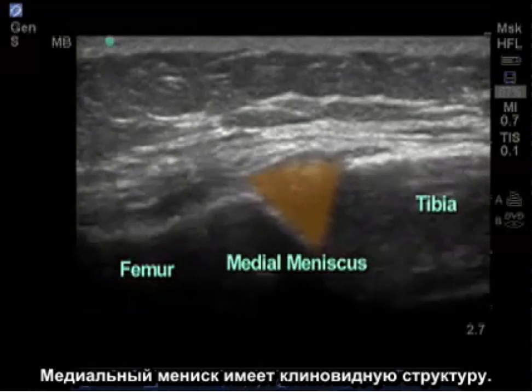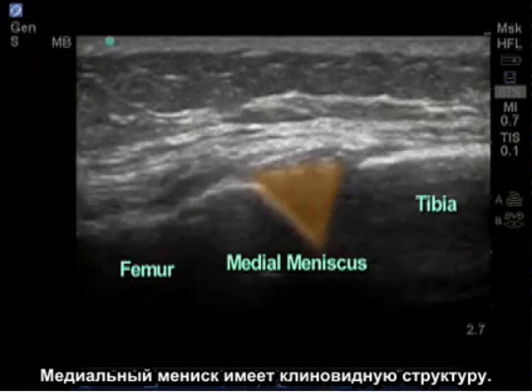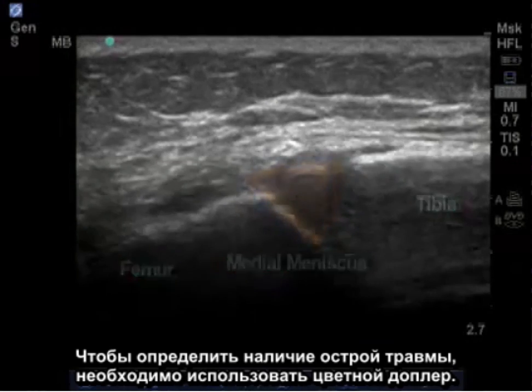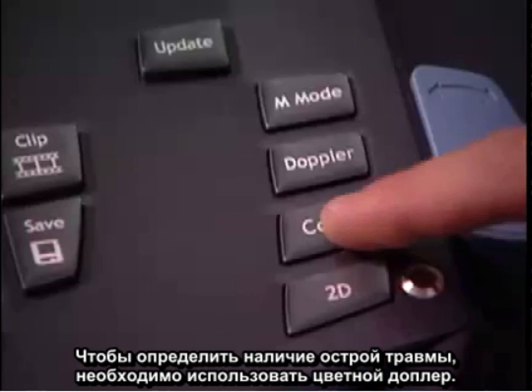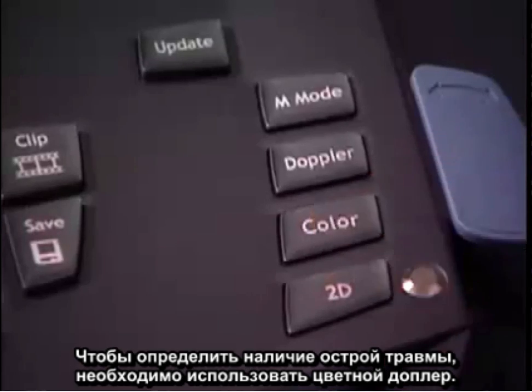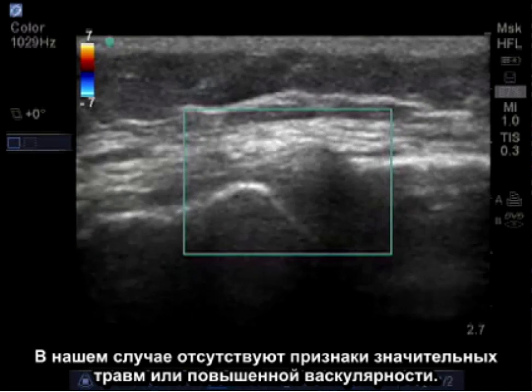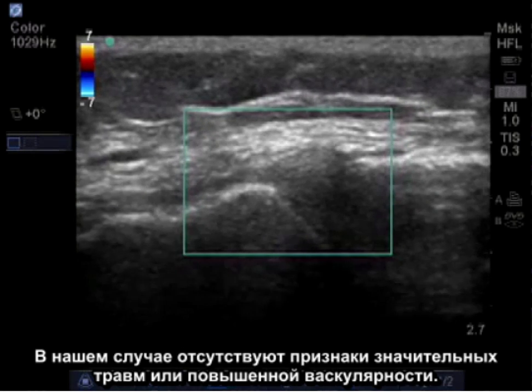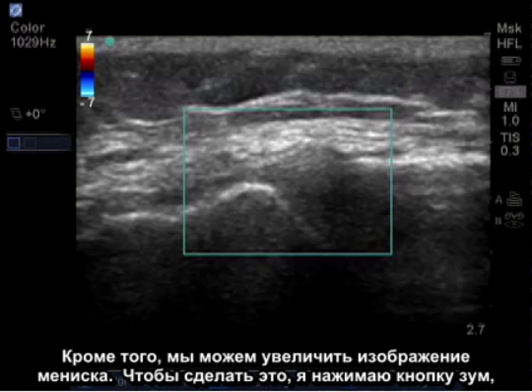The medial meniscus is a wedge-like structure. To determine if there's acute trauma, we can put color Doppler on the meniscus. Here there's no significant trauma or suggestion of any increased vascularity. In addition, we can zoom into the meniscus.